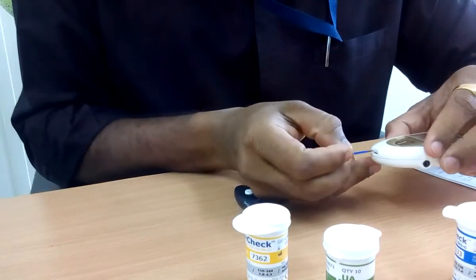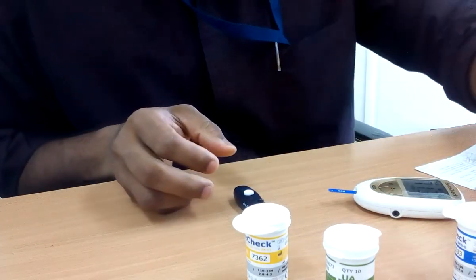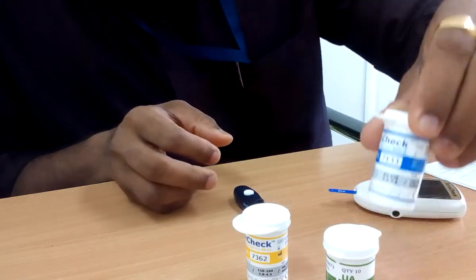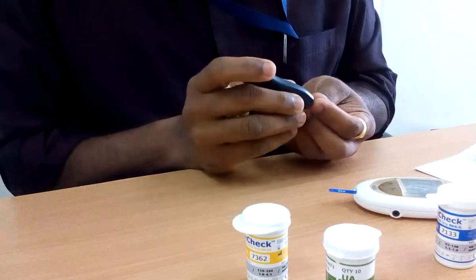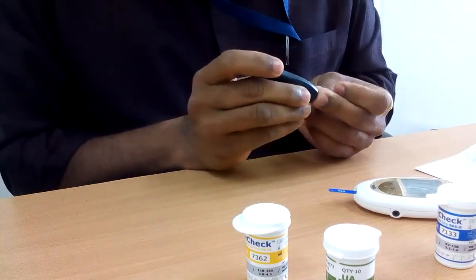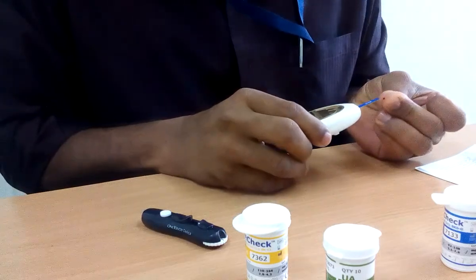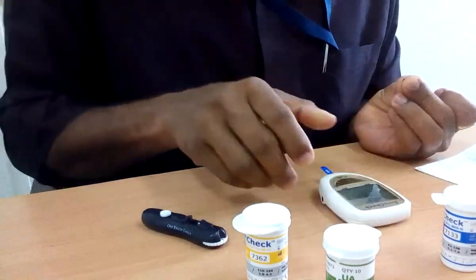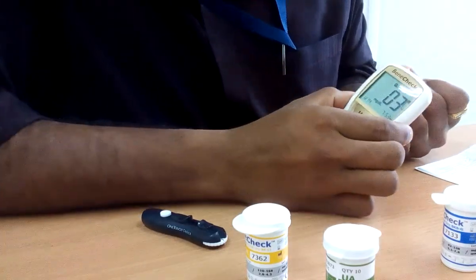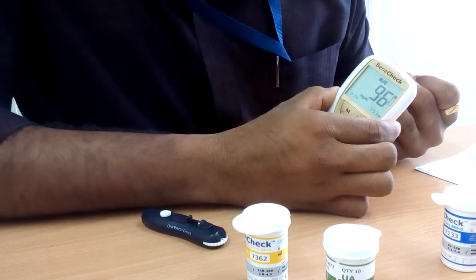I insert the strip for glucose. It shows 7133, so 7133 is the right number. I am having a test now, and my glucose level is 96.